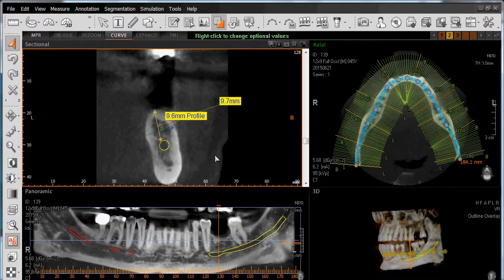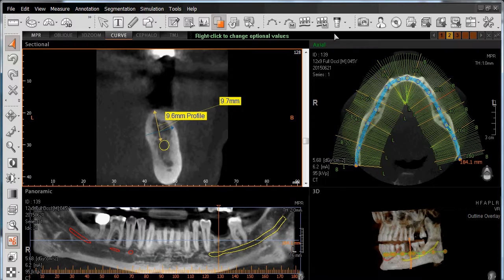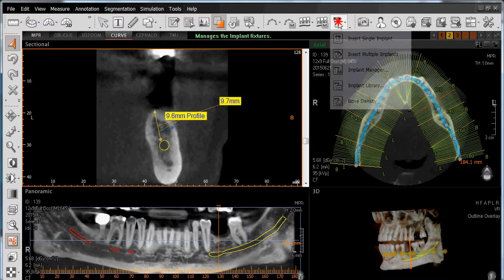We've identified the site where we're going to place our virtual implant, which is going to be at site number 19 using the US Tooth Numbering System, or number 36 using the Canadian Tooth Numbering System. From here, we'll navigate to the toolbar and left-click on Implant.